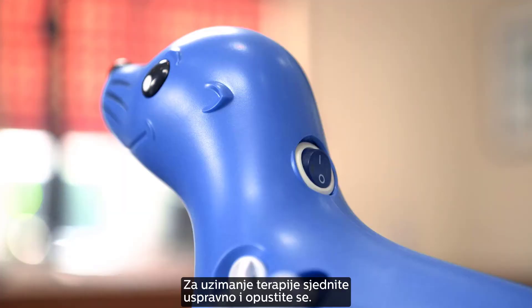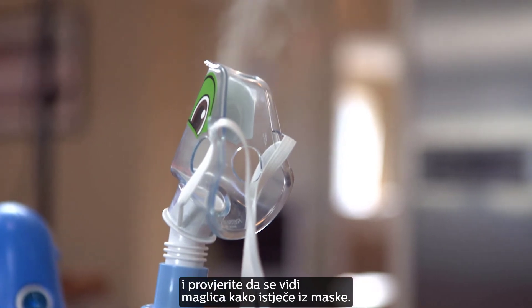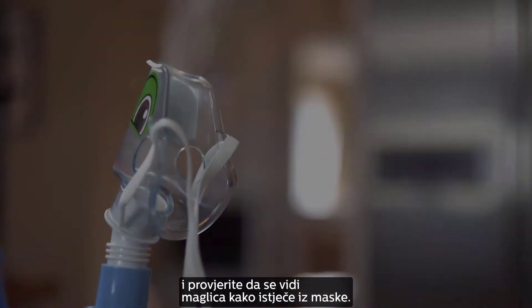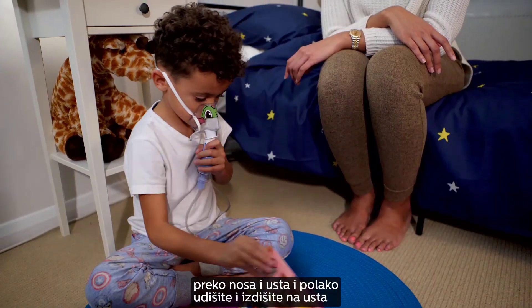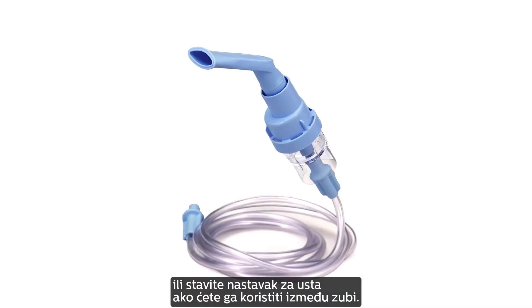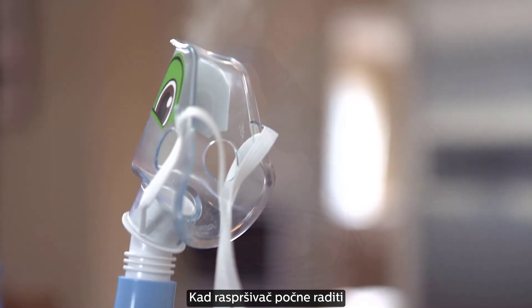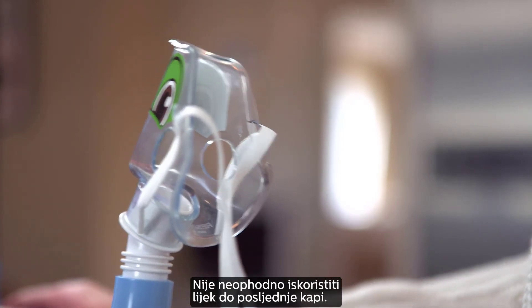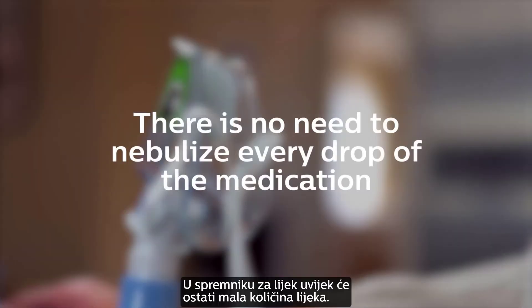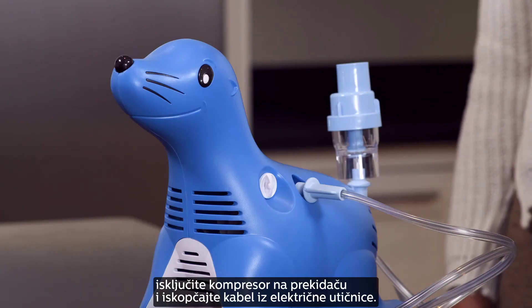If you are ready to take the treatment, sit in an upright position and relax. Switch on the compressor. Make sure mist is visibly coming from the mouthpiece or mask. Place the mask in position over nose and mouth and breathe slowly in and out through your mouth. Or take the mouthpiece between your teeth, surround it with your lips, and breathe in and out slowly through your mouth. When the Sidestream begins to work intermittently and sputters, then the treatment is finished. There is no need to nebulize every drop of your medication — there will always be a small amount left in the medicine cup. When your treatment is complete, turn the power switch off and unplug the device from the electrical outlet.